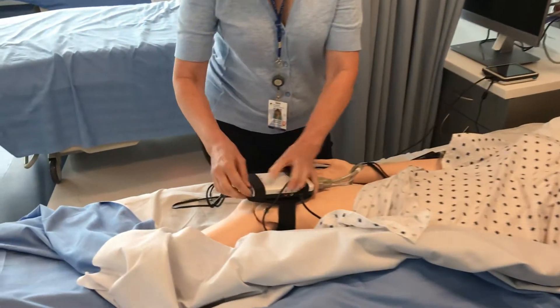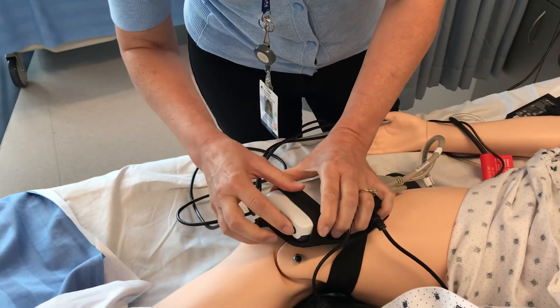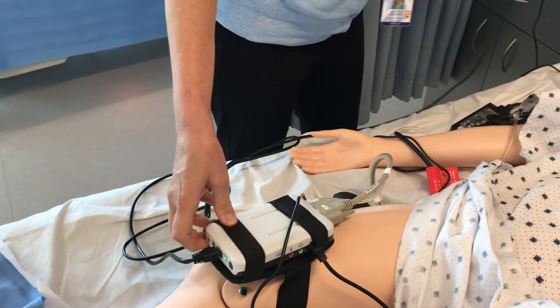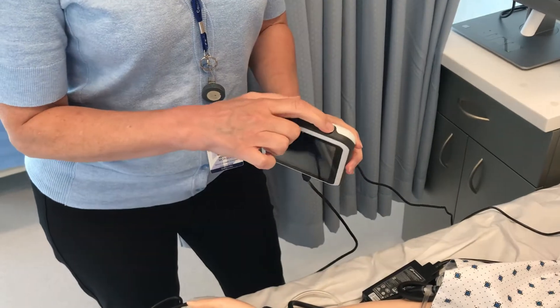So what you're going to do first of all to start this, you're going to turn two things on: one is a button on the link box, and the other is the button on the top of the SimPad Plus.